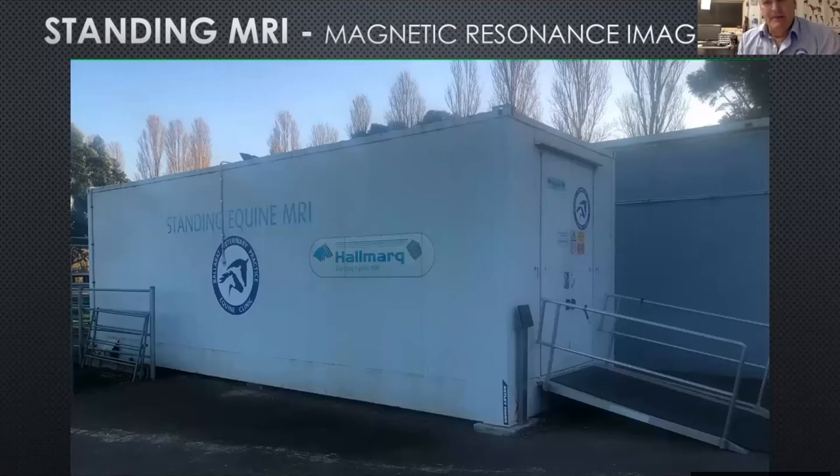The company Hallmarq in England started putting these together several years ago as a modality of making it more available to more practitioners, because probably 80% to 90% of lameness has always been stated as being from the knee or hock down, and this is what this machine can do — it can go from the knee or the hock down to the ground.